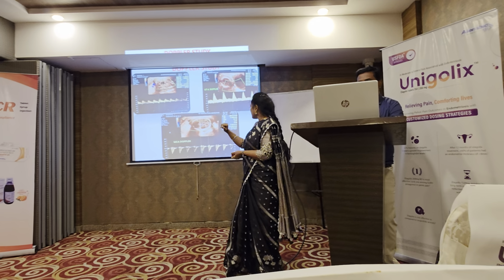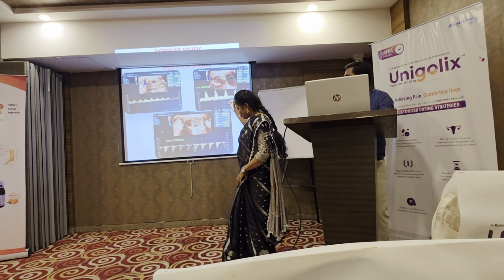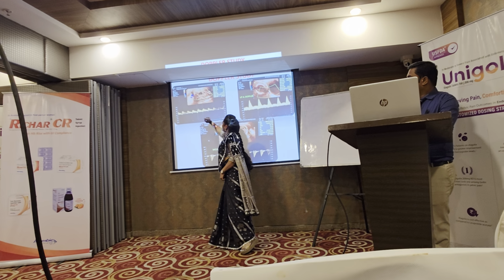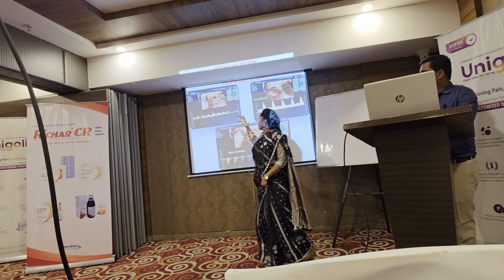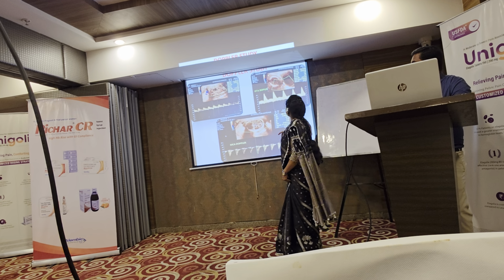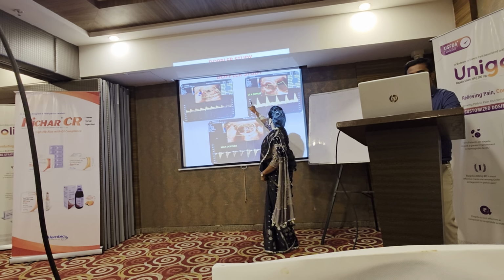In the umbilical artery, the diastolic flow should be more this way. If it is a good amount of diastolic flow, it means the baby is getting enough flow from the mother. Uterine artery Doppler is exactly opposite.